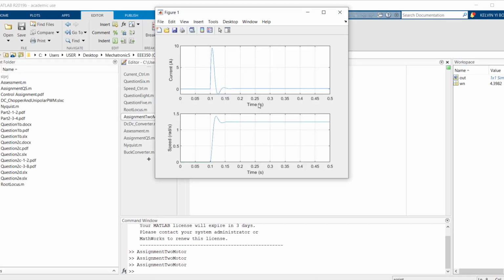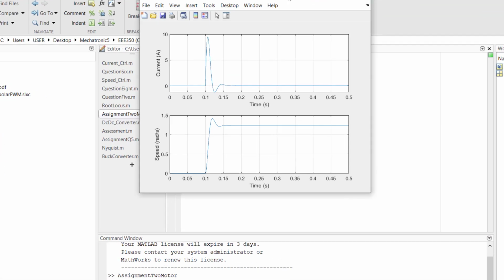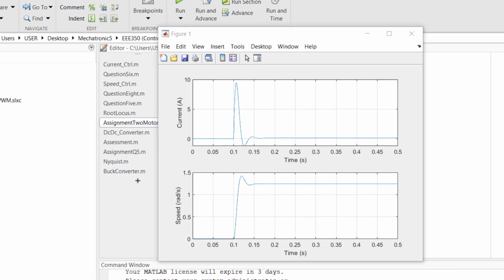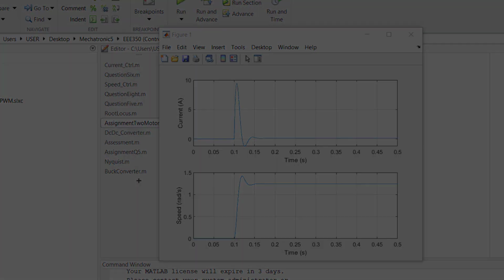From the result, the inrush current seems to be extremely high, which is expected from the DC motor working principle, that is, the rotor at stationary does not create a back EMF that impedes the armature current. The induced voltage in the motor is a function of the speed. However, there are limitations in a physical system that limit the current drawn from the motor driver by the motor.